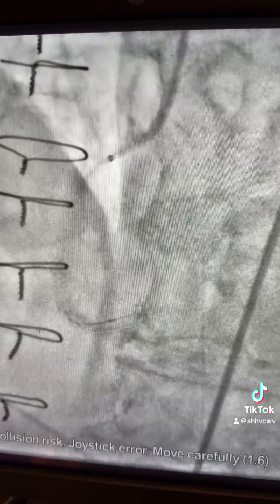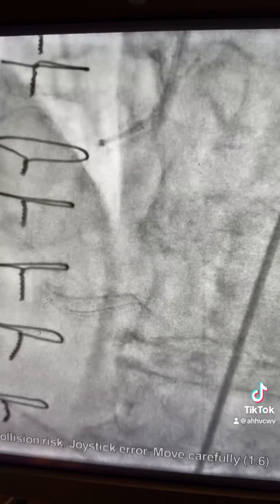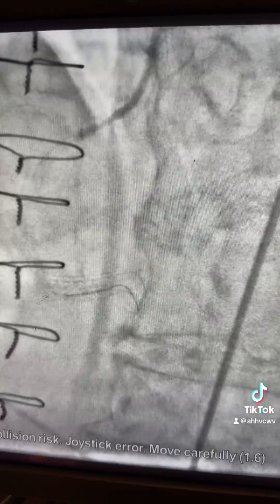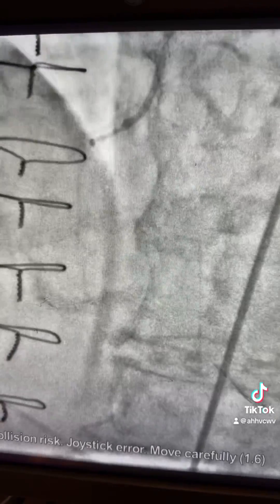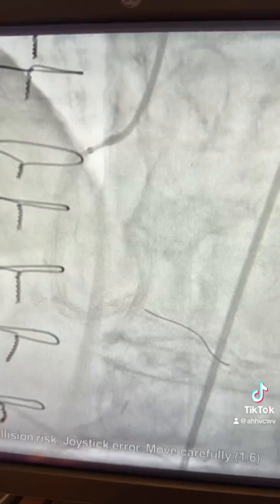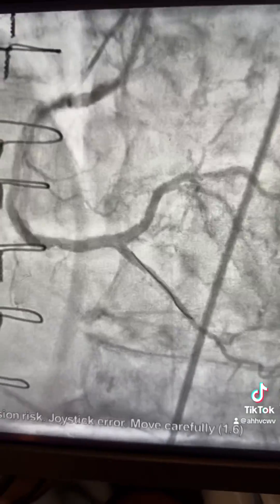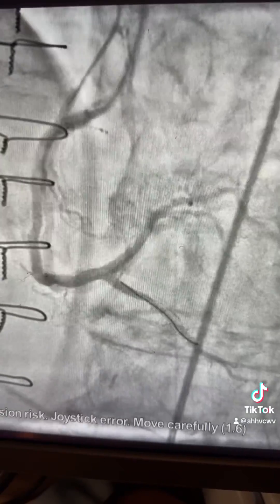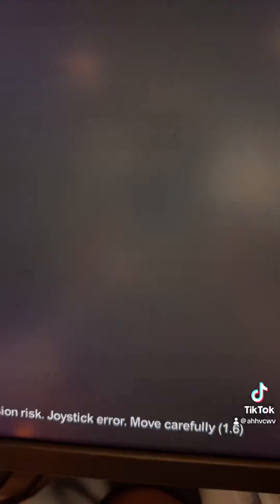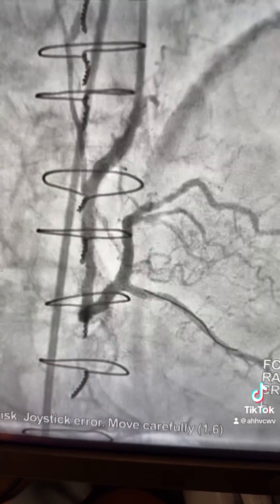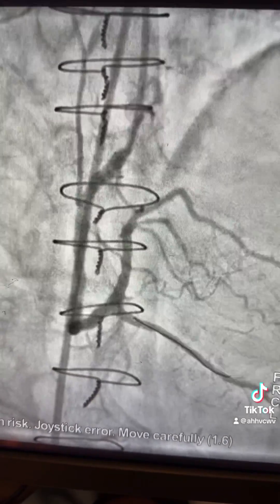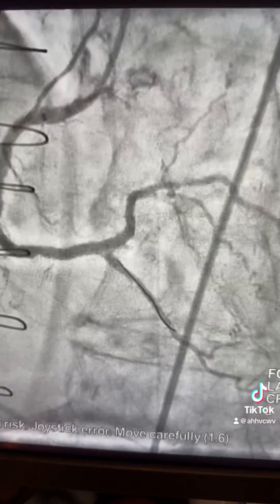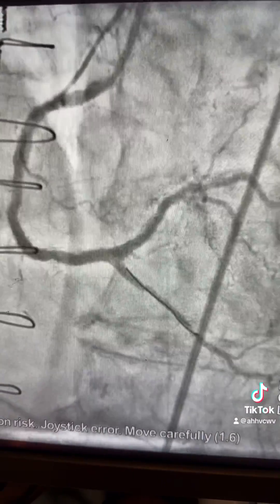Stent in the RCA to PL, then pull and advance the wire through the struts into the PDA. Final results shown. Thank you.